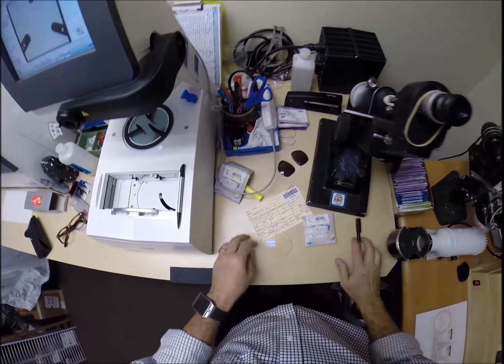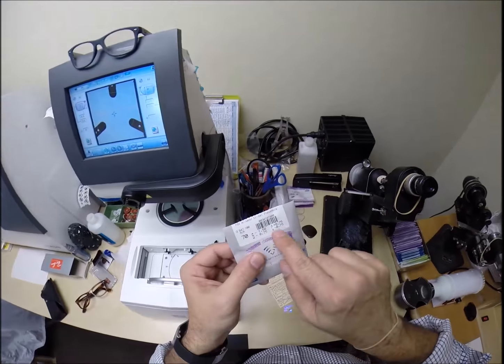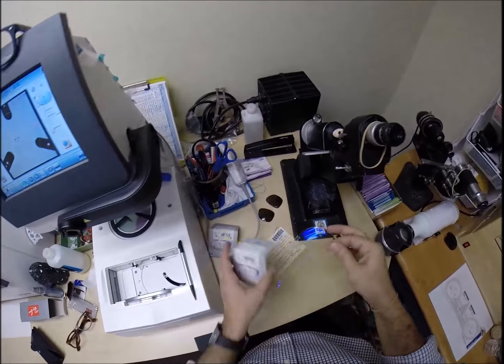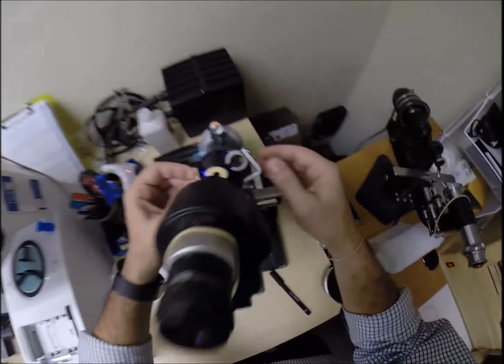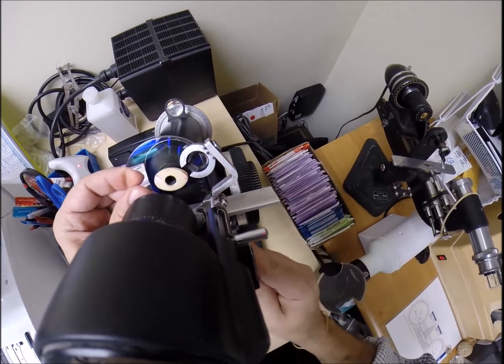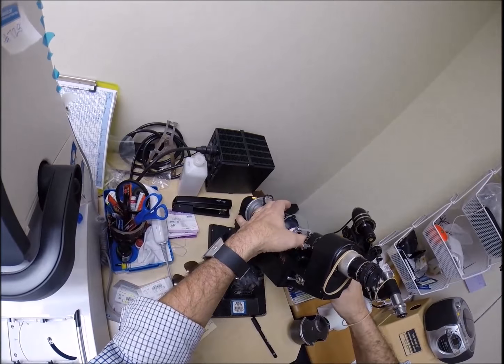Let's do the same thing now for the left. Minus 75 at 170. Take the lens out of the protective sleeve. Take the laminate off the front of the lens. Put the power drum on. Well, we're still on minus 75, so that's good. Rotate the lens until the spherical component comes in clearly. Check your astigmatism correction. Everything is lining up, and I'll explain all that in just a little bit.